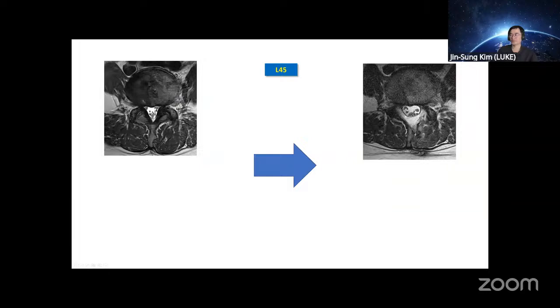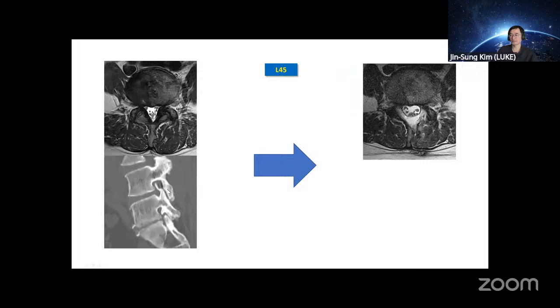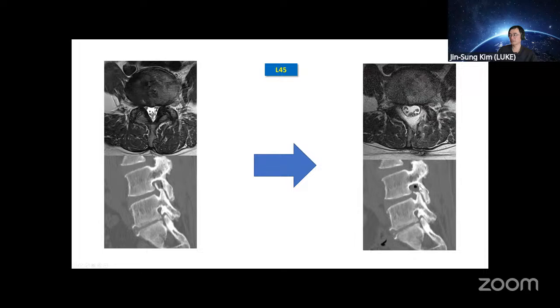Among the 3 levels, 4-5 is mostly a little bit interesting compared to the other levels. You can see the pre-op bony spur. By going over the top with an additional interlaminar foraminotomy, I was able to take out the tip of the SAP, calcified and pinching the exiting nerve root.